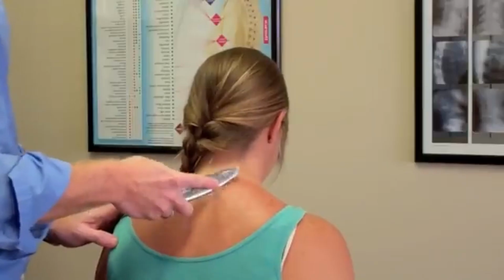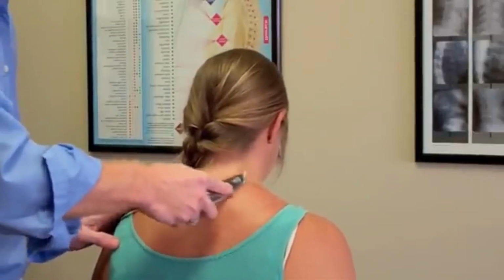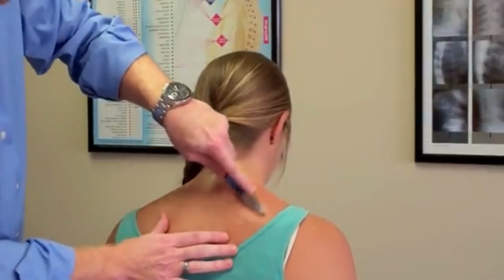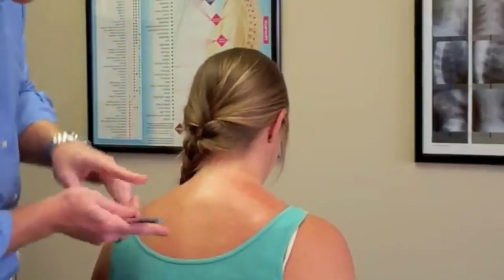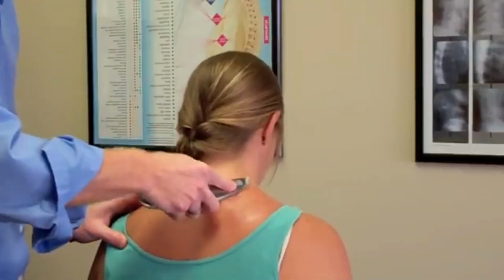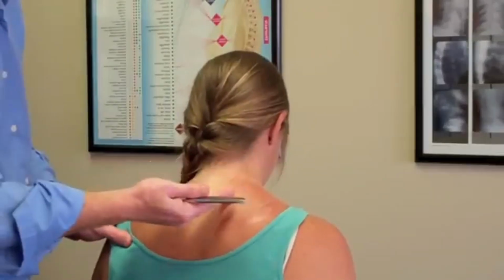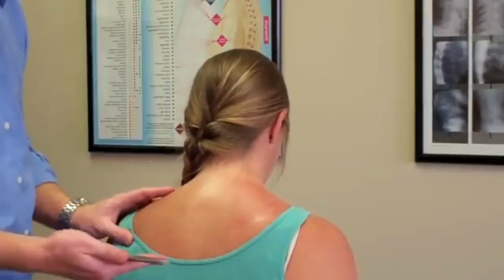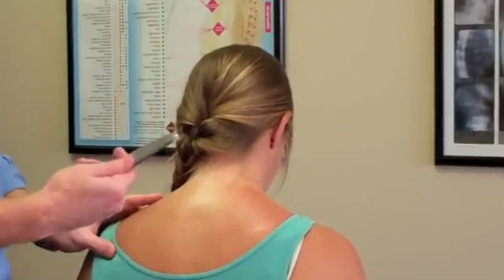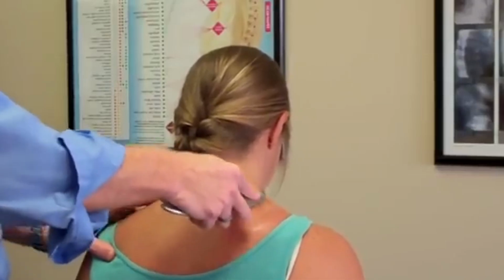So after the emollient spread evenly over this, we're breaking all this up, and you'll see in here her skin's starting to get red. And what's happening is that the Graston is creating a histamine response in the skin. Now we can only break up so much scar tissue per treatment, because eventually this histamine response may actually cause some light bruising or some occasionally heavy bruising. That's why you have to make sure that the patient isn't on any blood thinners such as Coumadin or warfarin.